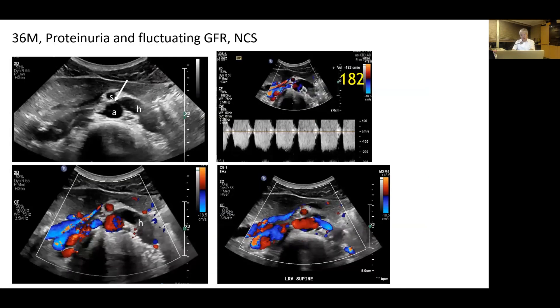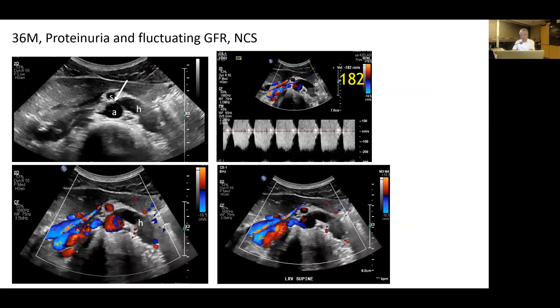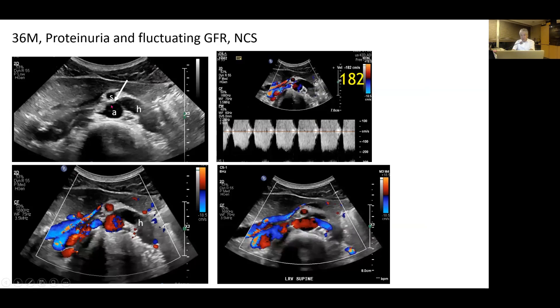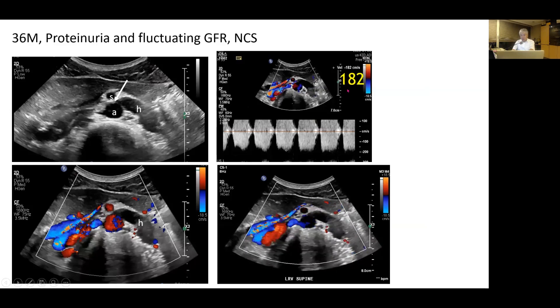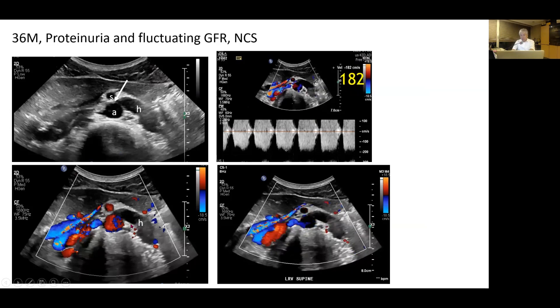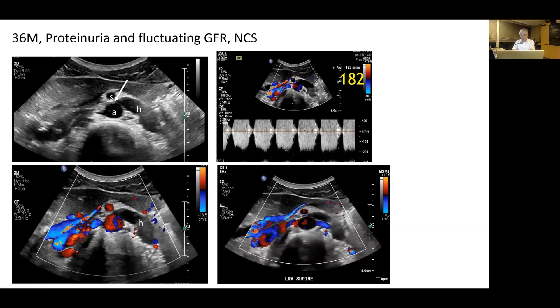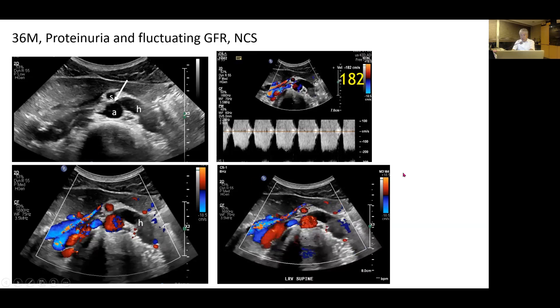A 36-year-old man with proteinuria and fluctuating glomerular filtration rate due to severe Nutcracker syndrome: the aorto-mesenteric left renal vein is tightly compressed between the aorta and superior mesenteric artery with a peak flow velocity of 182 cm/s. Absent flow signals in the dilated hilar left renal vein indicate stagnant flow. In severe Nutcracker syndrome, glomerular filtration rate can fluctuate between morning and evening.